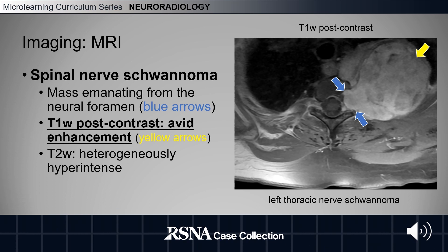Schwannomas can also occur within spinal nerves as a mass emanating from the neural foramen, as shown by the blue arrows in our image to the right. We still see avid post-contrast enhancement on T1-weighted images.